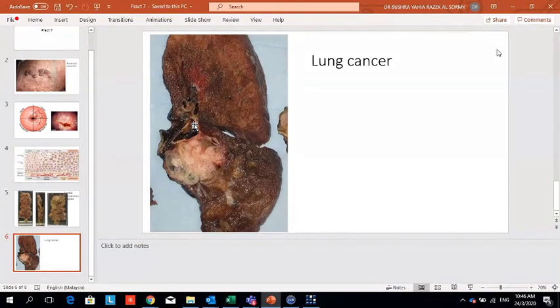Black area. This area is what in the lung? The bronchial. Yeah, this is what you call the hilar area or hilum. In the hilum, you can see the blood vessels and bronchus. So, can you see this tumor? The tumor is irregular, isn't it?